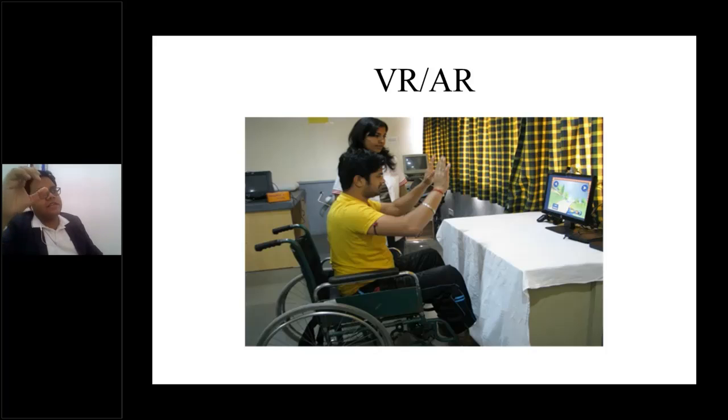Now, these things are increasingly being used. I'm pretty sure a lot of my orthopedic friends are being approached by companies who are using augmented reality and virtual reality in rehabilitation. But if this game is just serving the purpose of a game and is not helping in strengthening your extensors, flexors, or whatever exercises for the knee, and it is not doing those exercises, it has to be reported and not just used without purpose. So this reporting has to be done.